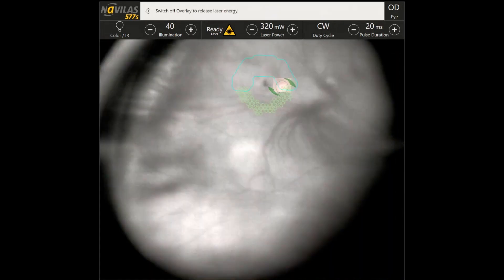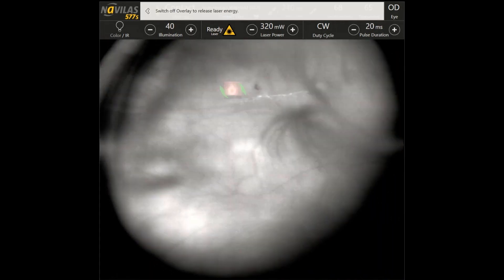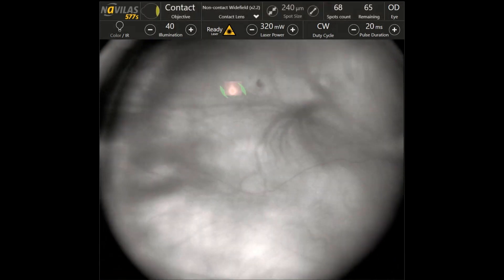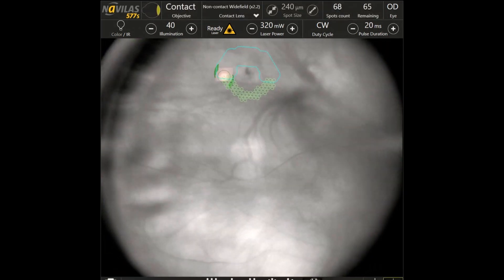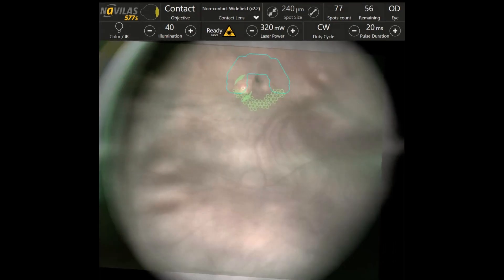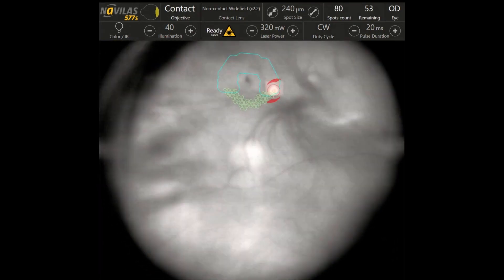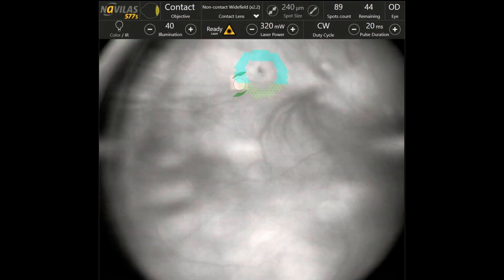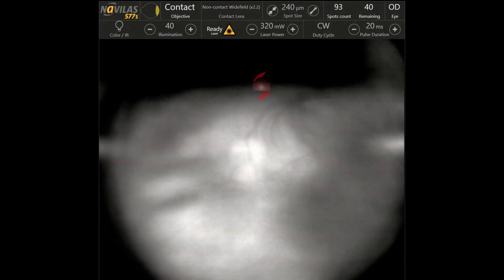The color fundus image used during the planning procedure is automatically overlaid over the live infrared peripheral retina image, and must be approved by the retina practitioner during treatment to deliver laser to the appropriate area and to assure safety.